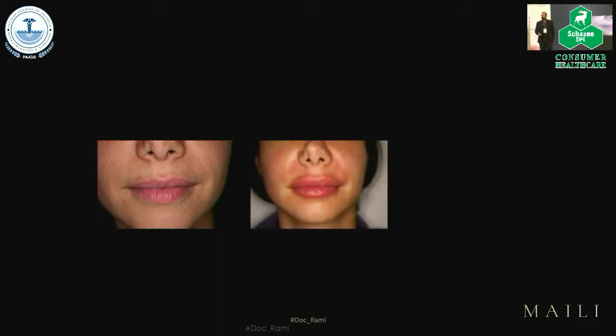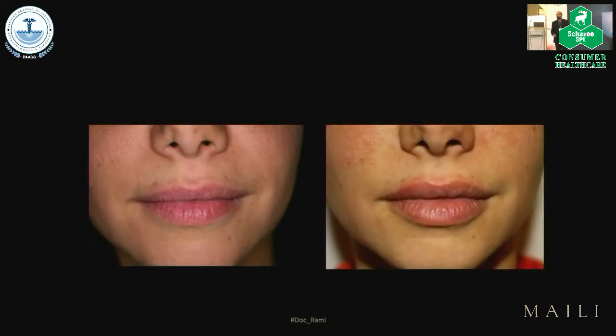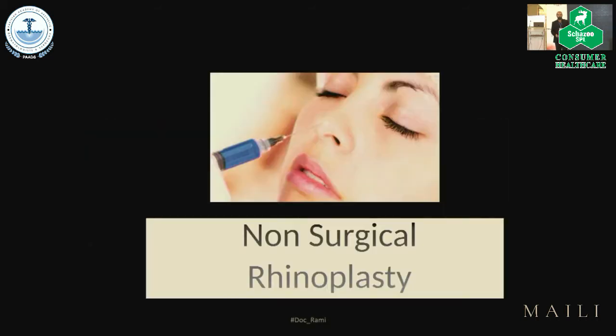But always remember, when it comes to lips, you inform your patients that there will be swelling, and there will be a lot of swelling. So this is the patient I saw 12 hours after injecting the lips. This is how swollen she is, and then this is how she looks after. So lips do swell. Make sure you inform your patient that's going to happen.